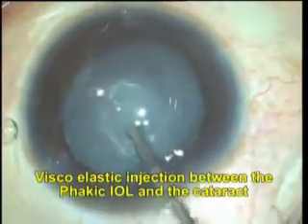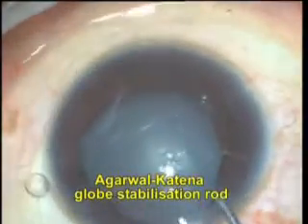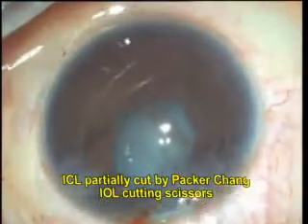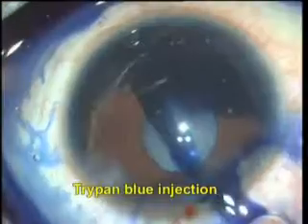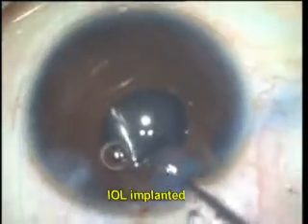Viscoelastic is injected between the ICL and the cataractous lens, and the ICL is prolapsed into the anterior chamber. The ICL is partially cut and explanted by rotating it out. Trypan blue may be instilled to stain the capsule and the cataractous lens aspirated.